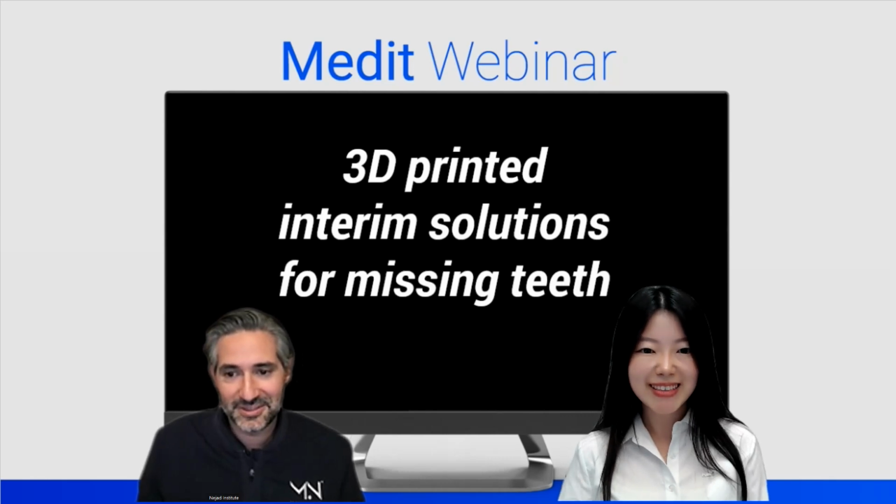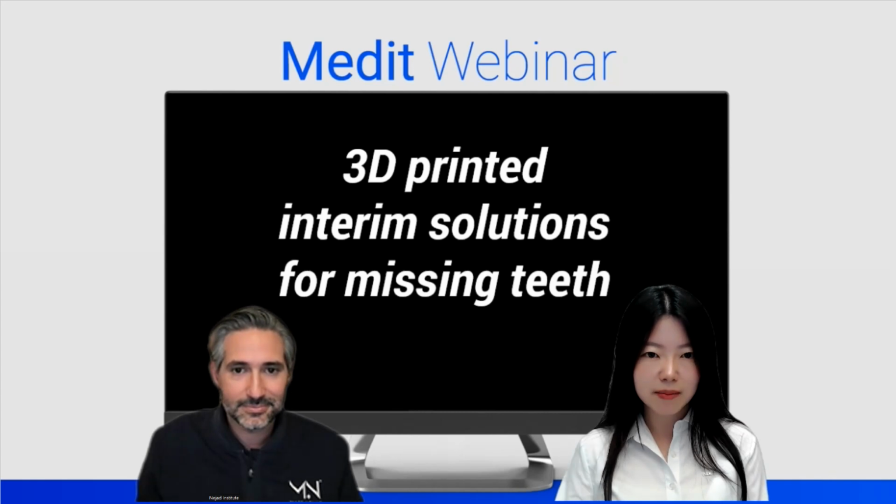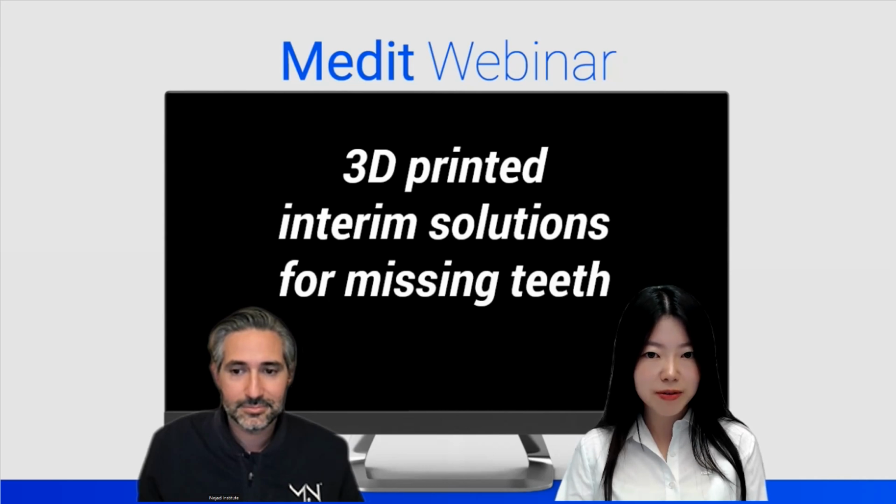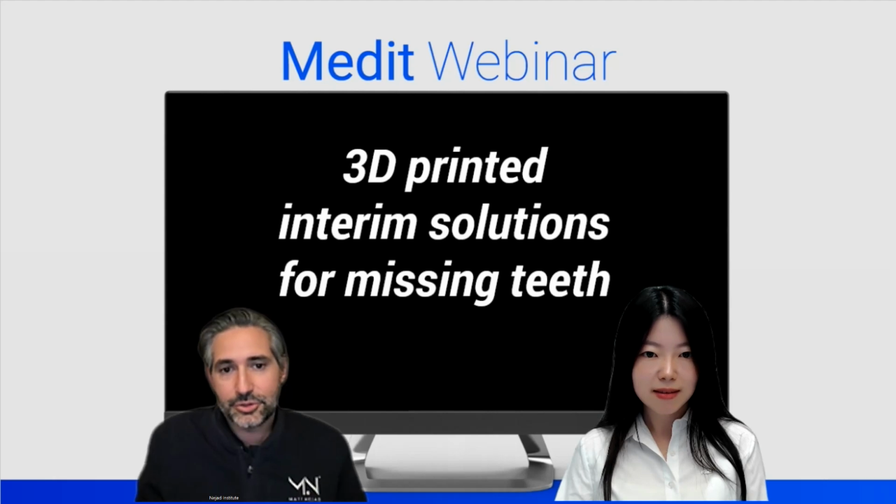I see. Okay, so let's talk about today's topic. It's about 3D printed interim solutions for missing teeth. So I was just wondering, is interim restoration exactly the same as the provisional restoration or something different? That's a good question.